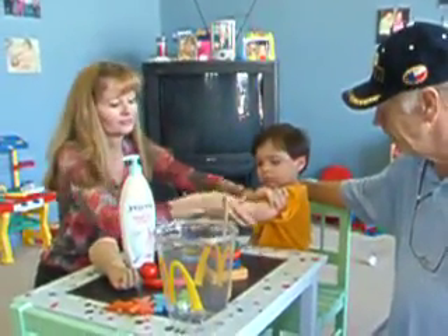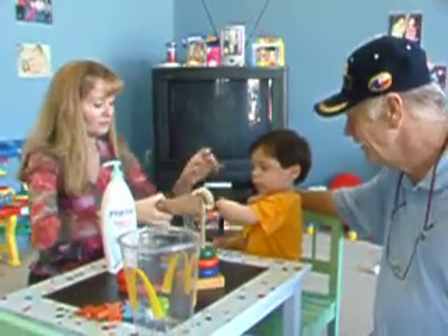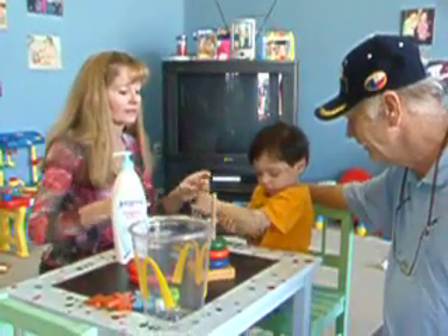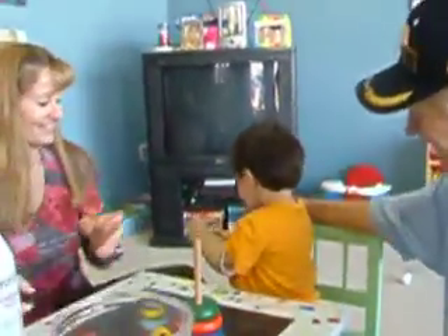A little bit of lotion just to make it easier. Are you ready for your new hand? Here we go. Well, you smarty pants. You just got it just right. Very good.